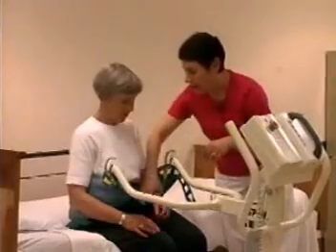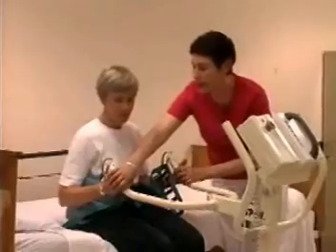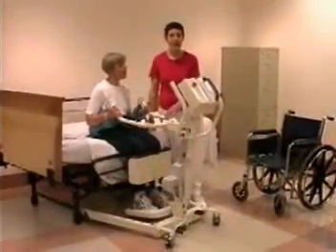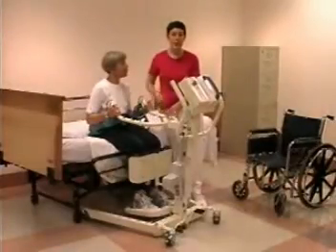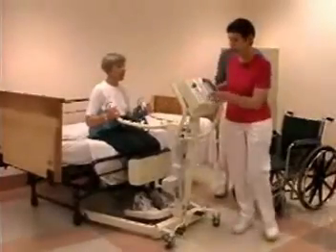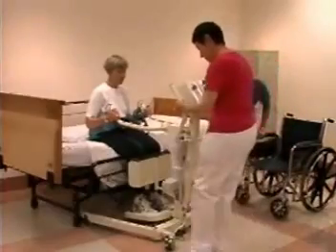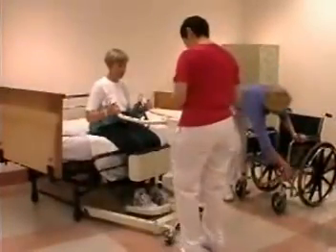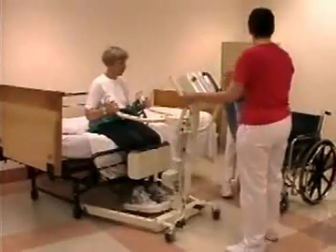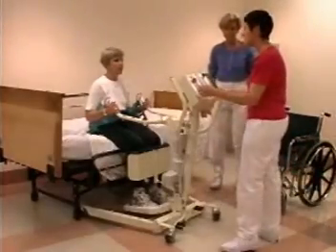Okay, now I'm going to have you put your arms on the outside of the sling and hold on to the lifting arms. I'm going to move around to the controls as our second person joins us to guide Mrs. Johnson into the wheelchair. We're going to unlock the base. And meanwhile, our second person has locked the wheelchair so that we're sure that the wheelchair isn't going to slide while we're doing the lift.